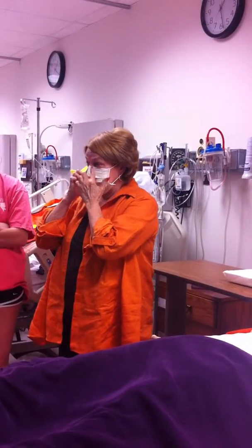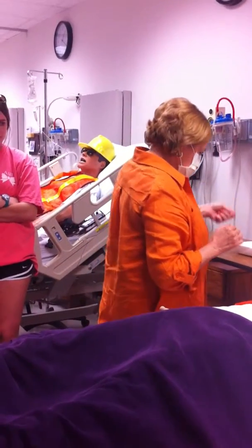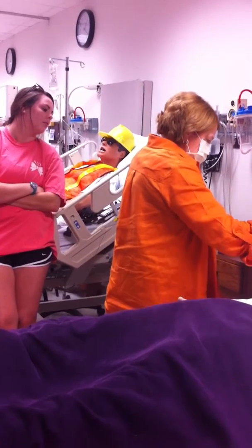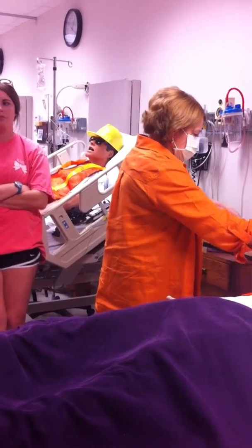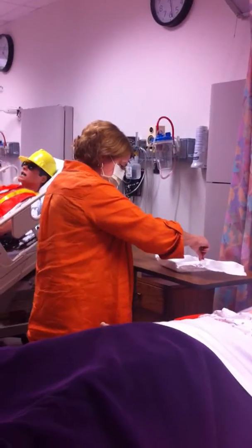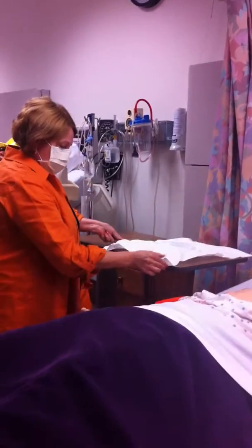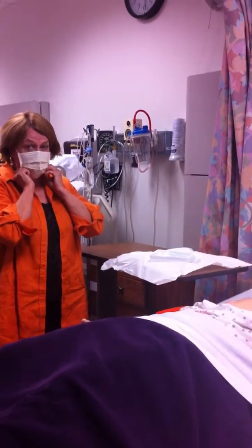Remember how to put on a mask, no pinching, pressing. Okay, away, and next is bottom, and I don't think I'm going to have to do sides this way because it's packaged that way. And remember, 1 inch around the perimeter of any sterile field is defined as non-sterile. So I can manipulate this and make sure that I get this to lay down nice and flat, because if it flops back over onto this area, then I've broken sterile technique.